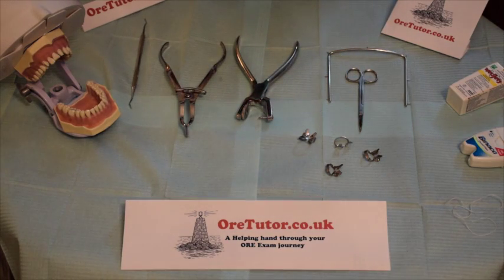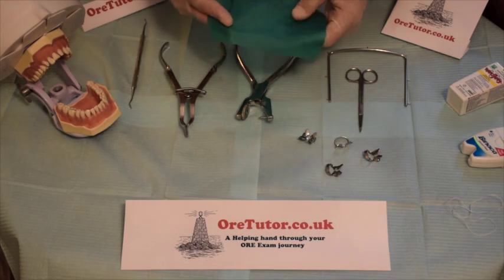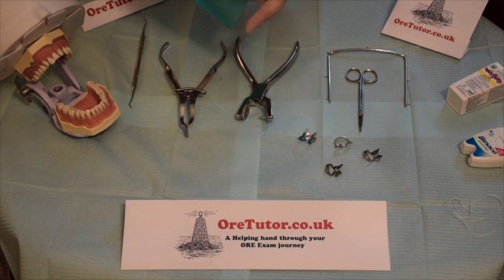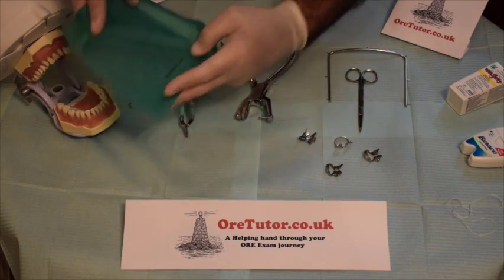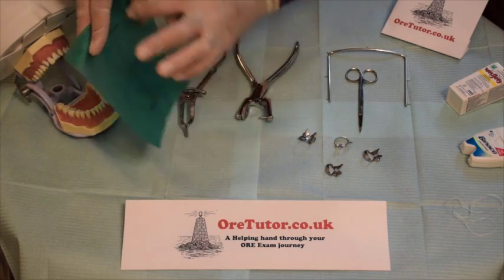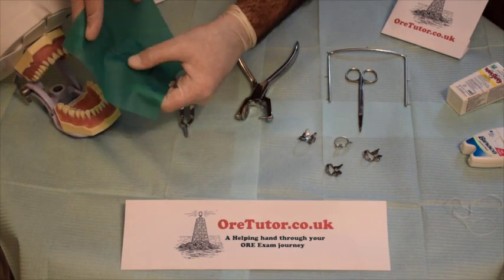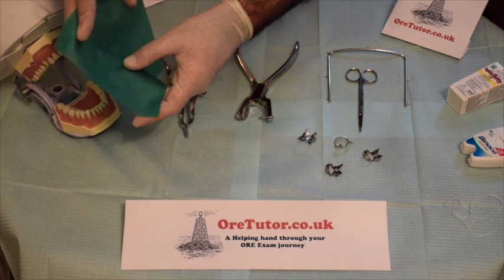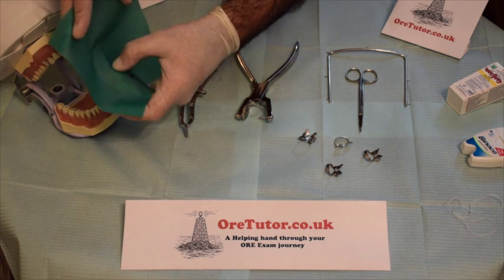Sometimes they provide you with a stamped rubber dam, sometimes an unstamped one. If it's stamped, just choose the hole where the lower first premolar is and punch it. If not, imagine the rubber dam on the patient's mouth divided into four quadrants, choose the quadrant you want to work in, and pierce it in the area where the tooth to be isolated is.